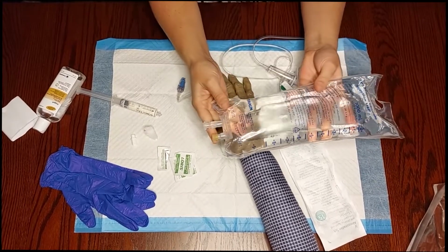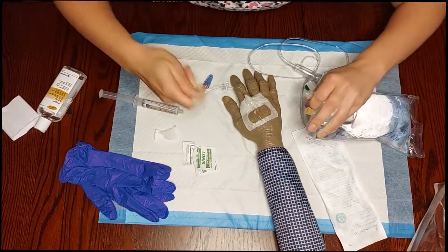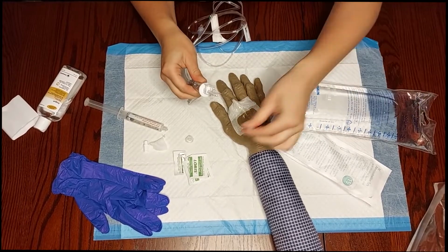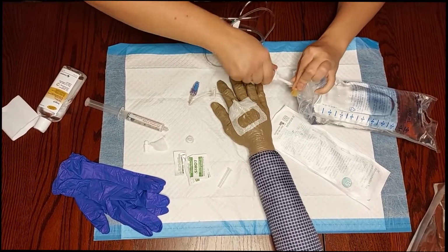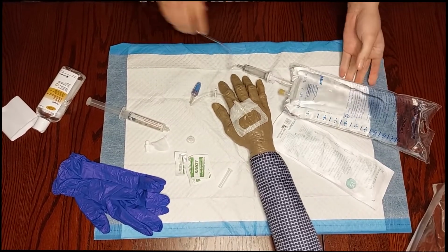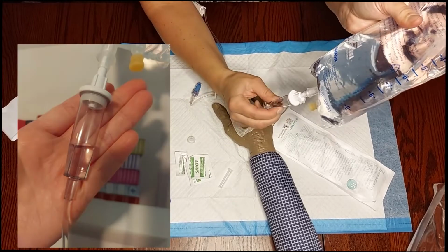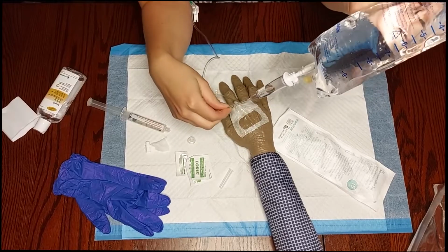And then we have our hydration bag here. We're going to pull that off. And then we are going to pull the cap off, and we're going to insert it straight in by twisting. Then you're going to stand the bag up and squeeze this to let some fluid in. I like to have it about halfway full. And then we're going to hang the bag for the rest.